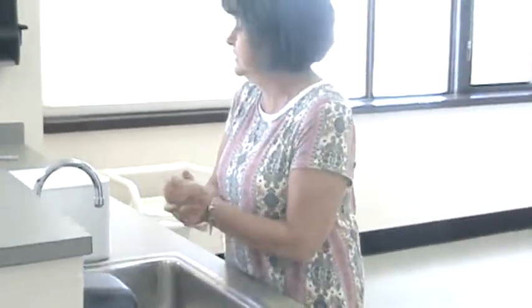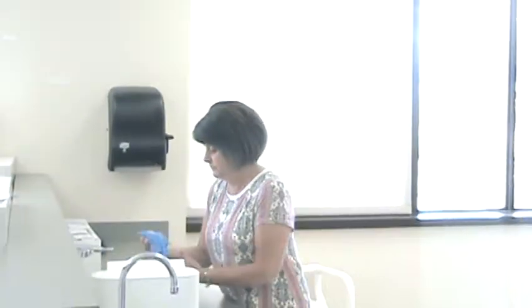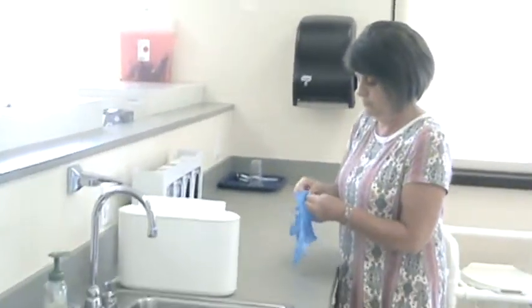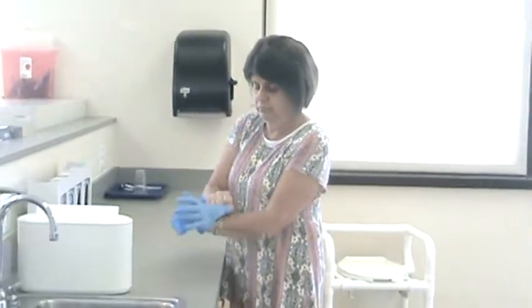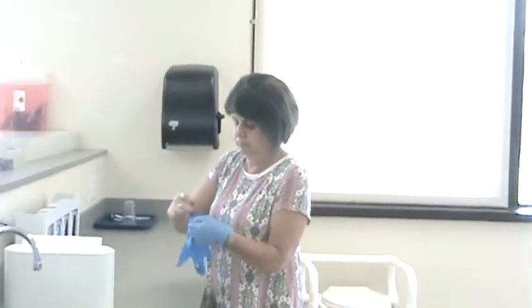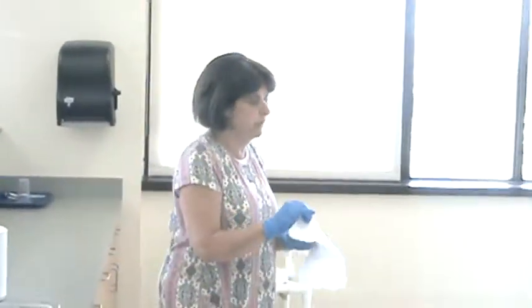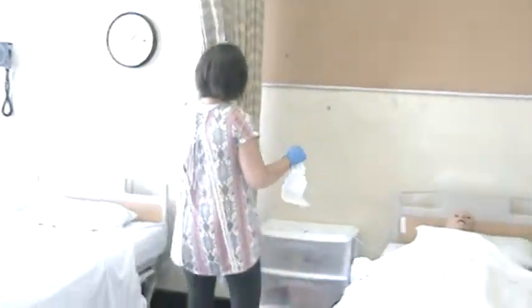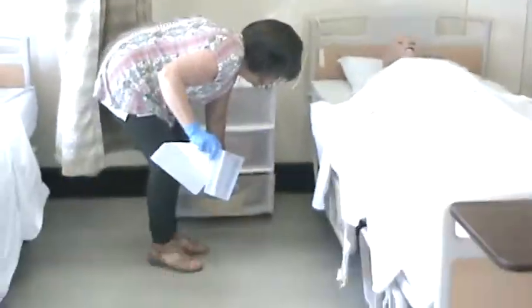I'm going to wash my hands for at least 20 seconds and then I'm going to put on my gloves. Take a paper towel for a barrier and the graduate container is in the bottom drawer.